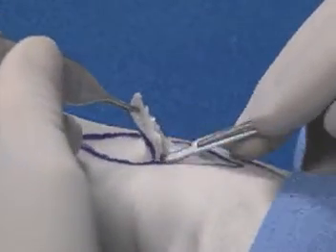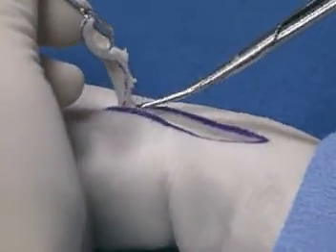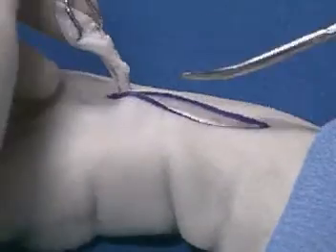The skin to be excised can be held with a forceps or a skin hook. The middle finger can also be used to aid in the retraction of the soft tissue during the dissection.